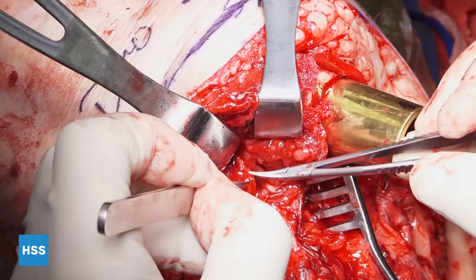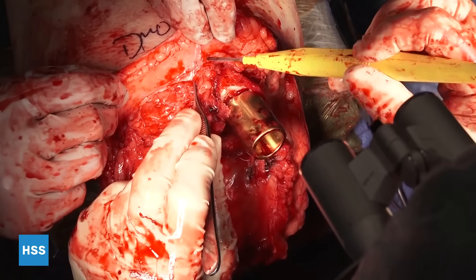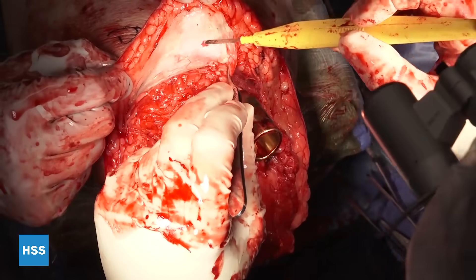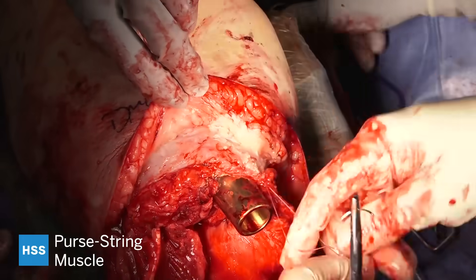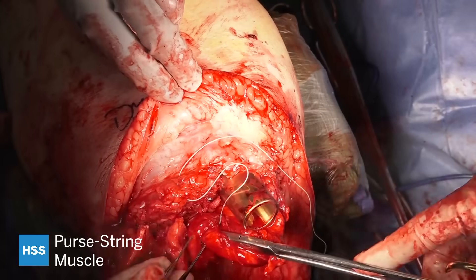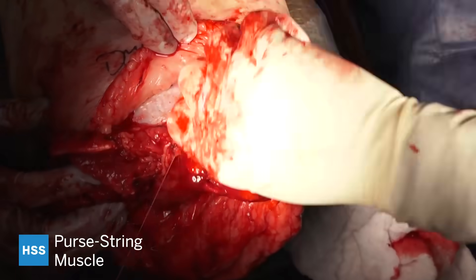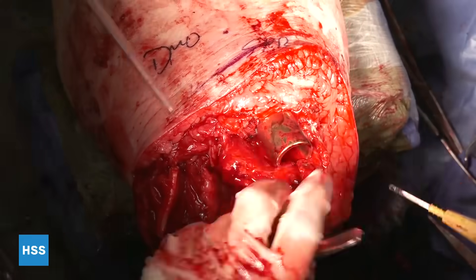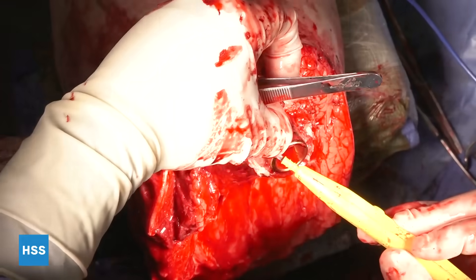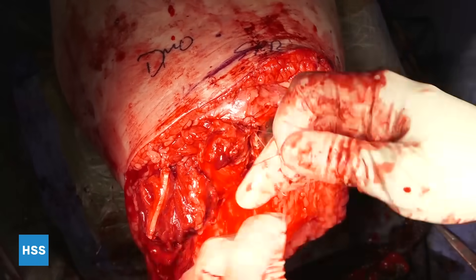It's important that the limb is not excessively moved or manipulated after this fine surgery is done. The flaps are created — the anterior flap is separated from the anterior musculature and the posterior flap from the posterior musculature. Then we do the purse string closure. The purse string basically creates a seal of muscle around the implant-bone junction. Excess muscle is removed as needed, and ideally the purse string creates a nice seal right at the implant-bone junction.